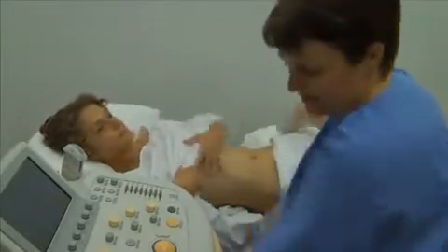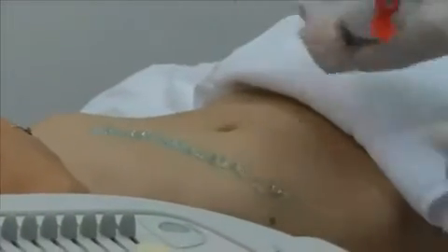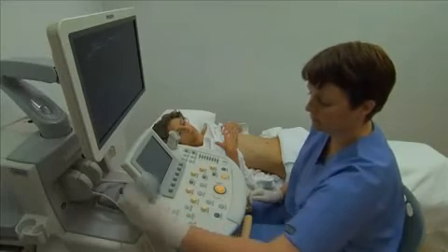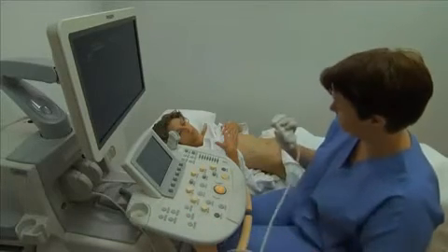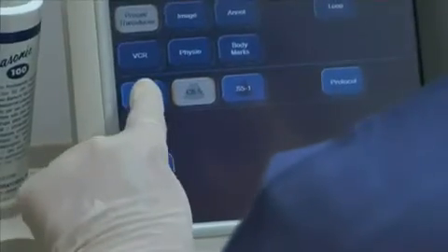Expose the patient's abdomen and apply gel to the right subcostal region from the epigastrium to the flank. Select a transducer of appropriate frequency and confirm the correct transducer selection and preset on the ultrasound machine.